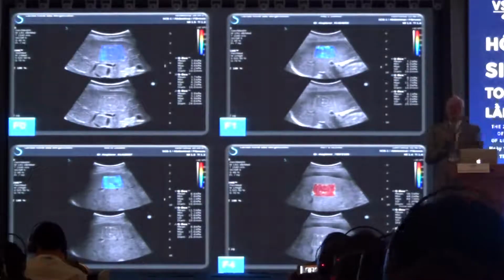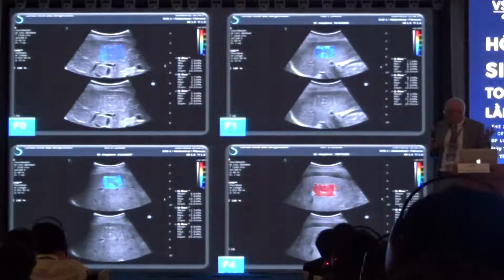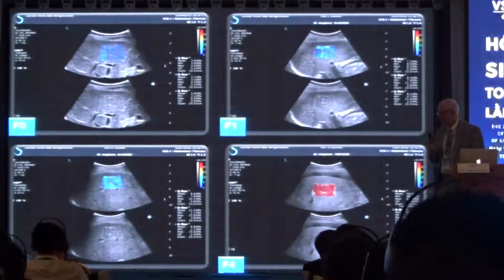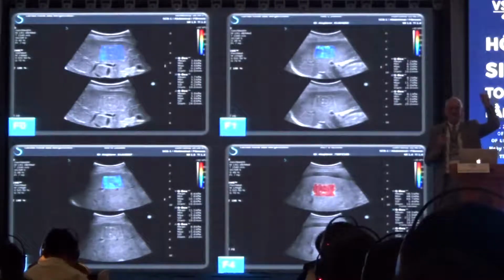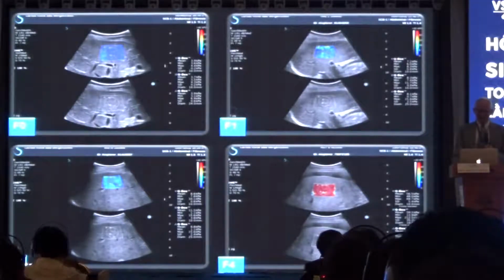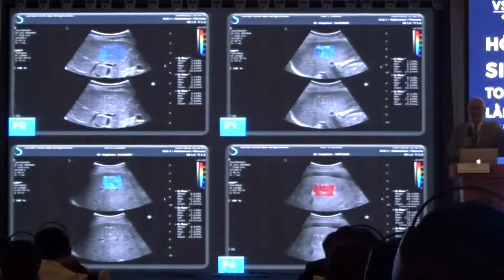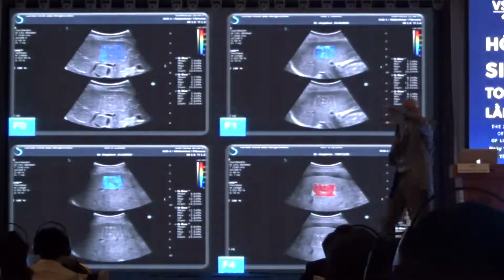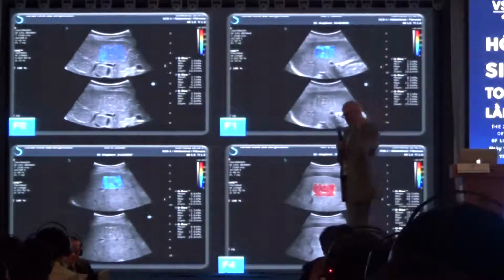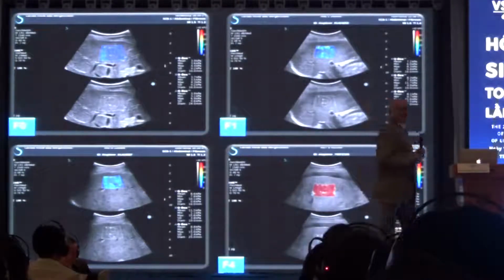So there is not only a risk of a liver biopsy, there is also the danger of getting no representative material, because the specimen is so small. And here you can see from 0 to liver cirrhosis, anything could be measured. The idea of the ultrasound method is to get a more representative sample, which is larger and might better reflect the situation in the entire liver.